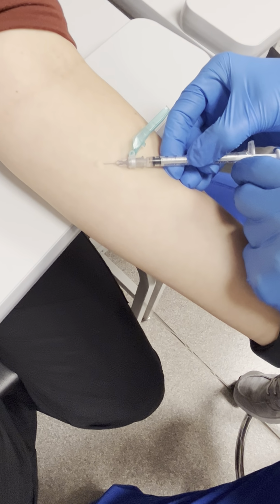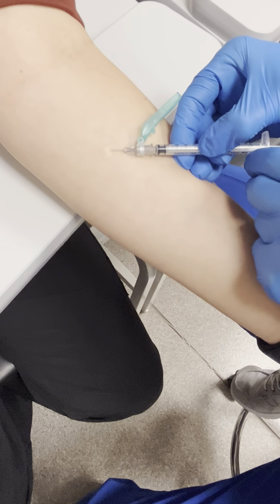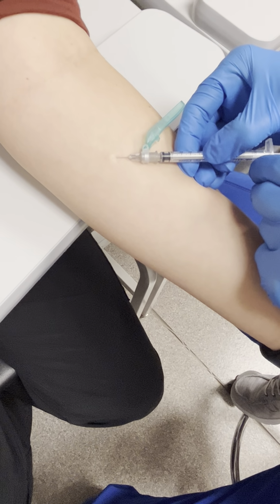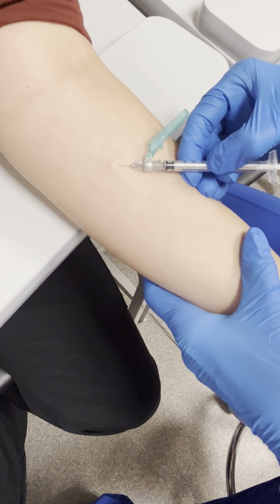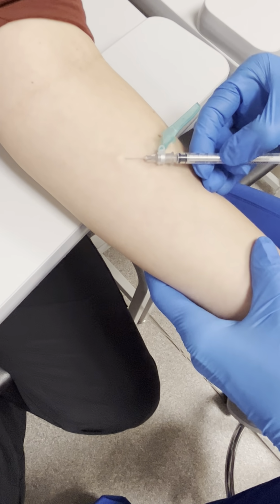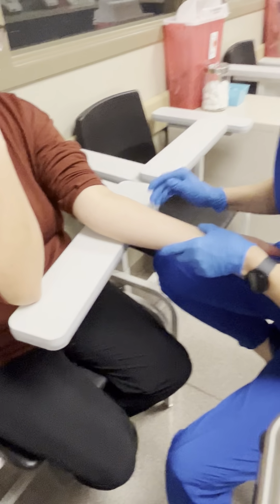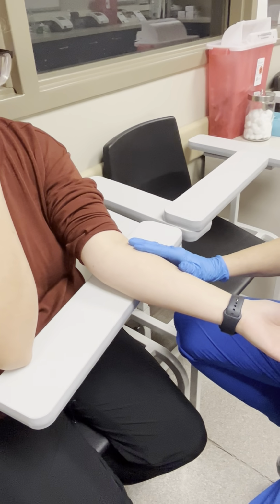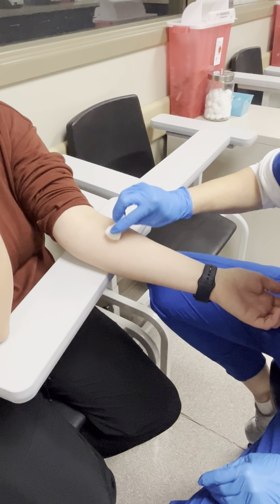What we want to see is the skin start to rise a little bit and create what we call a wheal. If you have a wheal, that means that you've had a successful plant of the TB shot. We're going to engage the safety, and we will dispose of that in the sharps container. So with this, there is a slight wheal there. There's a little bit of blood coming off of that, and we just want to wipe that gently.